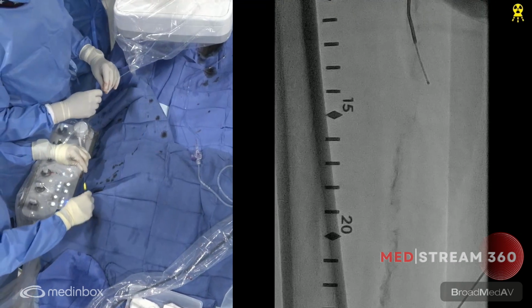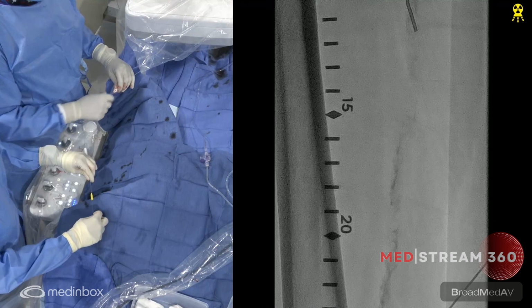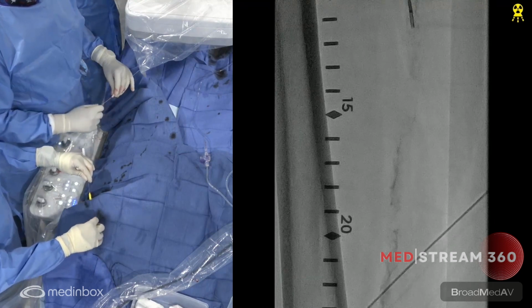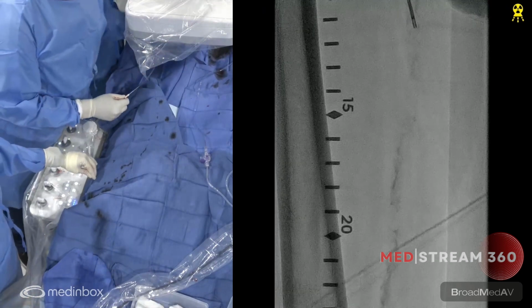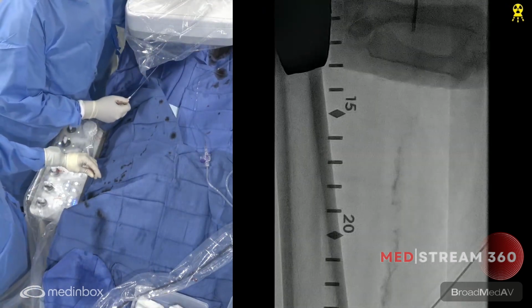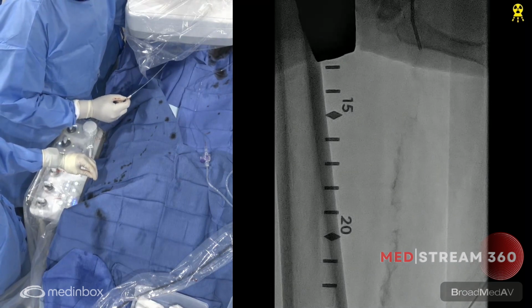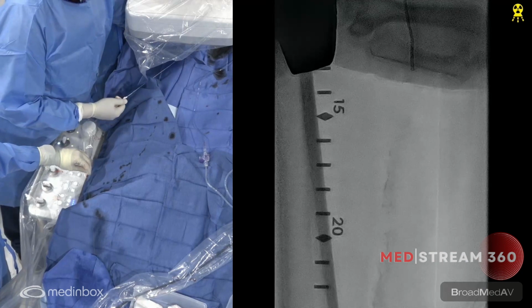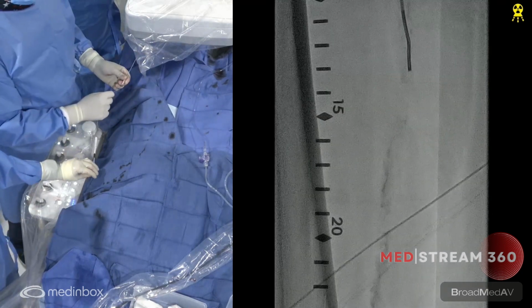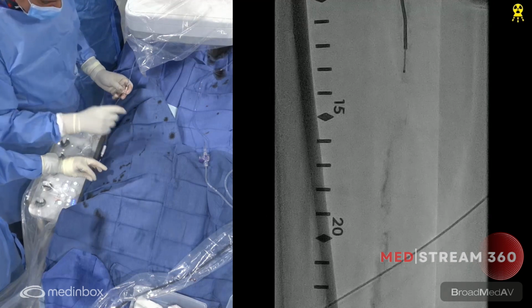So there's the Viance catheter that's going into a collateral, you can see there. So I'm just going to twist it away from that, and that's why you want the steerable catheter as much as possible here. So let me go ahead and twist this a little bit and try to get this down if I can. Let's see how this thing behaves. There you go. That seems to be a little bit better. And that seems to be the cap, I think. Let's see. And with calcified lesions, that's the cap for us.